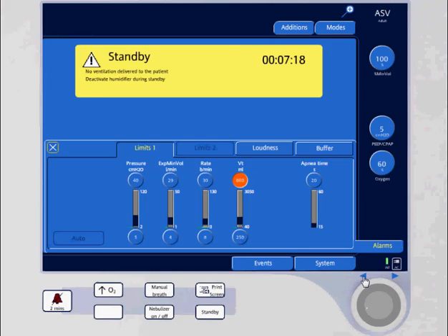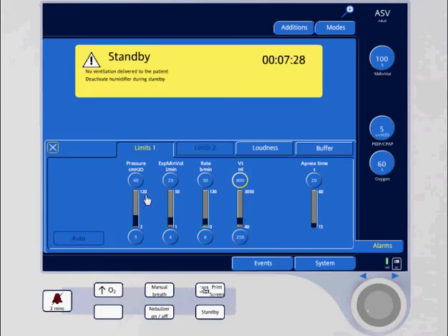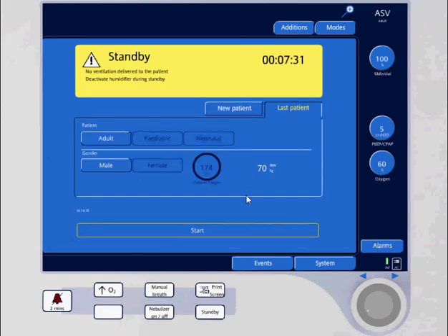I can also set a high tidal volume limit right here. When everything's appropriate, you can go ahead and start the mode of ventilation.